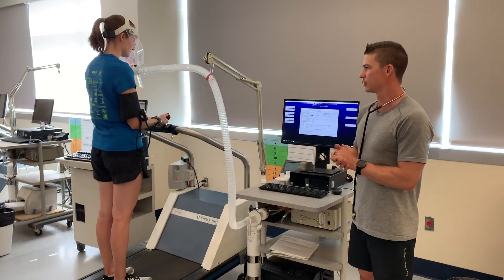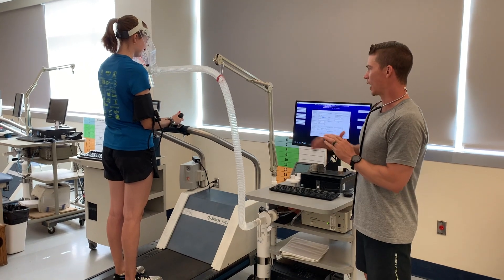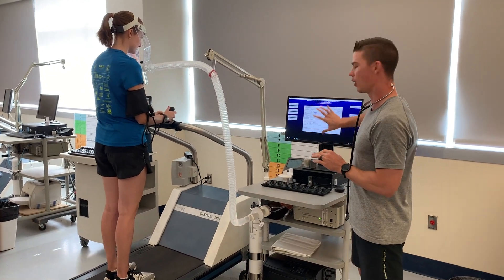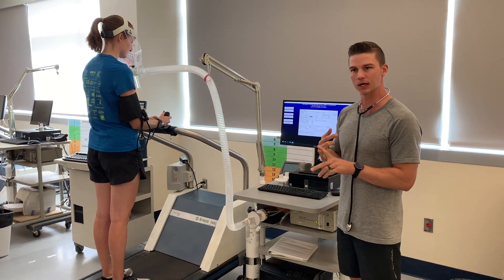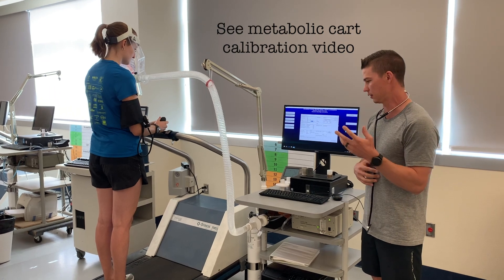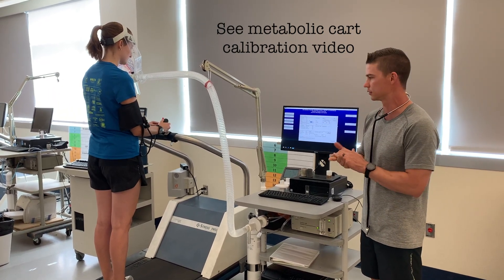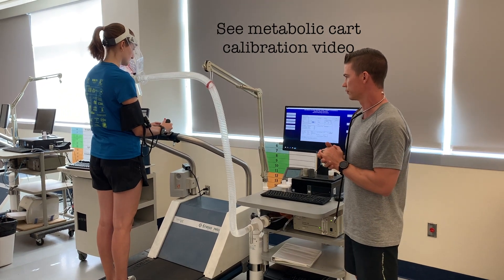We're going to do a VO2 max test with Betsy today. We've got everything set up for her. All of her information is in the cart. I've already calibrated the cart, the gases, and the flow meter. We'll go through how to do that in one of the lectures before you see this video, so this will just be some review for you.